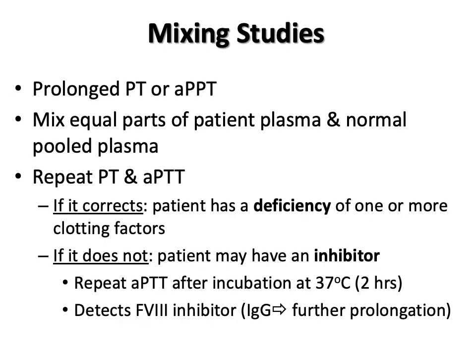Mixing studies can be performed on patients who exhibit an unexplained prolonged PT or APTT. They are used to detect factor deficiencies and specific factor inhibitors. The test requires mixing equal parts of patient plasma and normal pooled plasma. Then the PT or APTT is repeated.